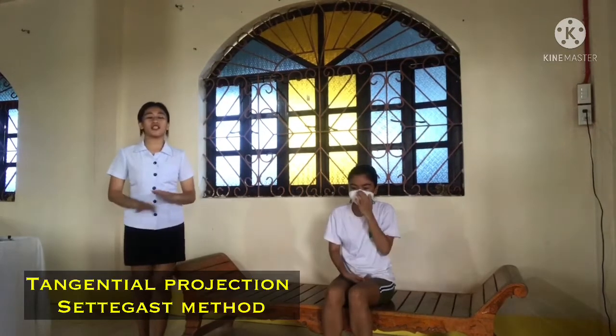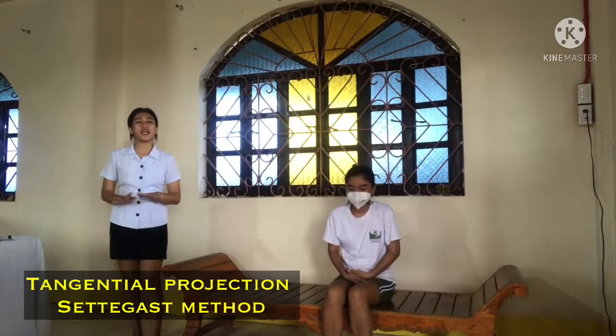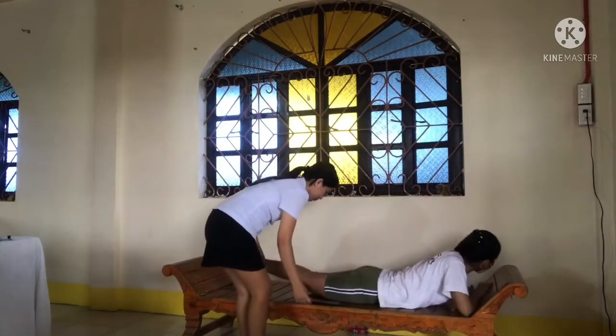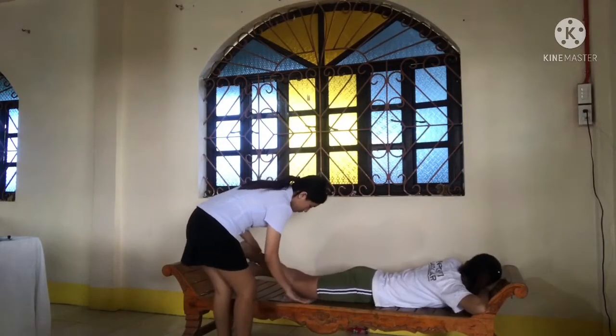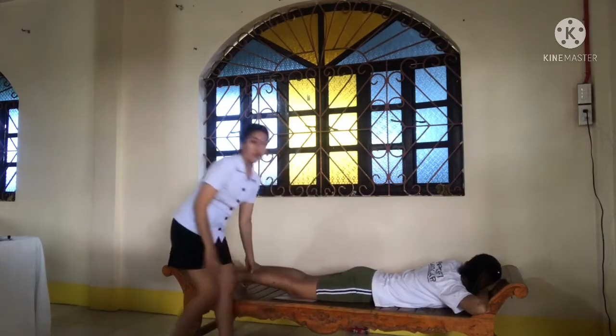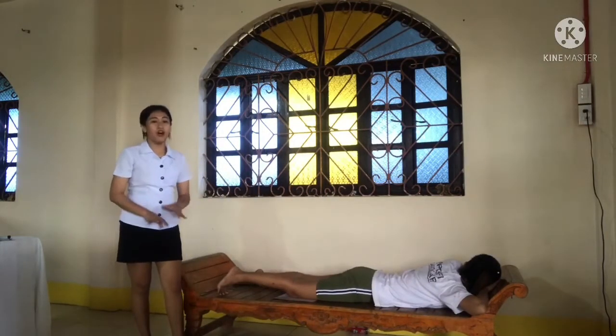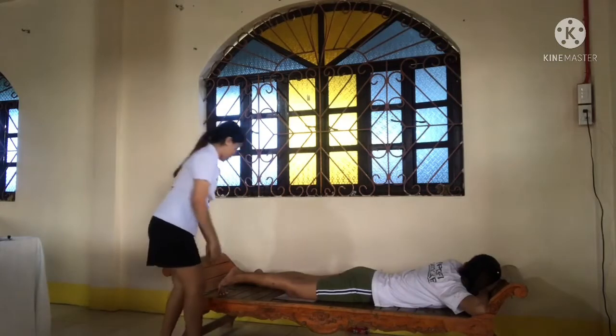Let's proceed to the tangential projection, Settegast method. So, the IR used for this projection is 8 by 10 inches. So place the patient in prone position. So flex the patient's knee slowly as much as possible or until the patella is perpendicular to the IR, if the patient's condition permits.